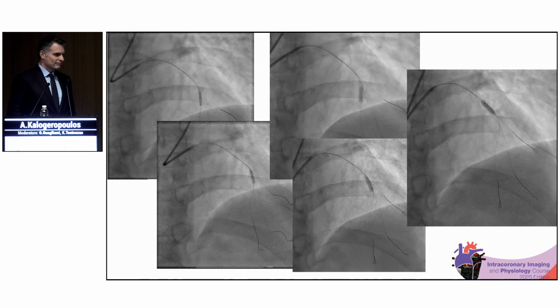So fibrotic means elastic recoil. And so he decided to make a significant incision at the segment involved by fibrotic tissue with a cutting balloon, which makes a deeper incision compared to the scoring balloon, which is a little bit more superficial. So this is based upon imaging.